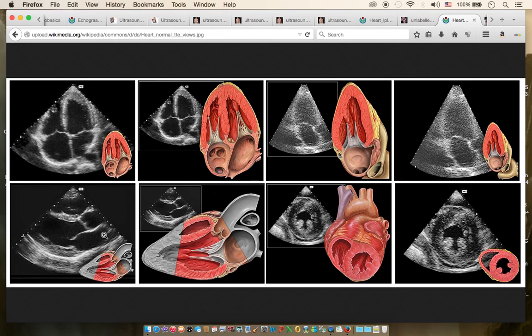There is another view, which is the apical view. You can see the four chambers and five chambers view. You see the aorta and the aortic valve with three cusps. If the patient has a bicuspid valve, it is very clear to pick up in this view.